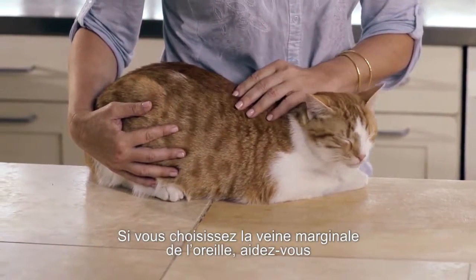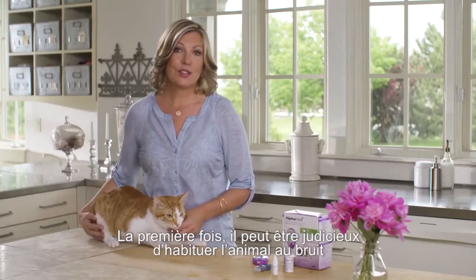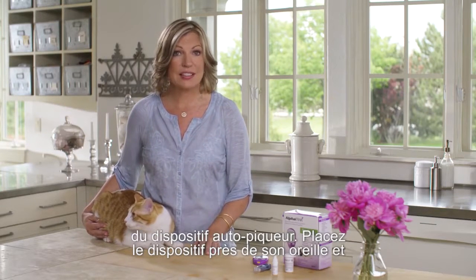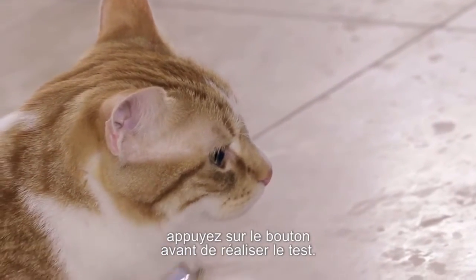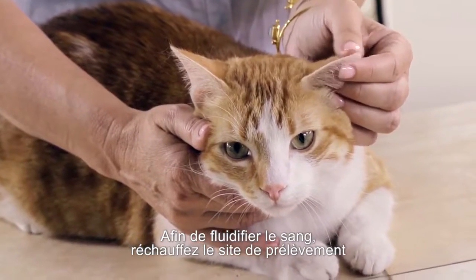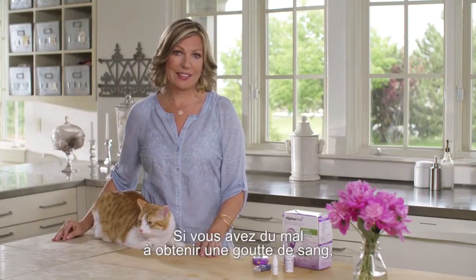If you choose the marginal ear vein and it's hard to see, it may help to use a flashlight to see the vein better. When you first start testing your pet, it may help to get them used to the lancing device sound, so try holding it close to their ear and pressing the button before performing the test. To get the blood flowing, warm the sample site by gently rubbing, applying a warm cloth, or a bag or sock filled with rice that has been warmed in the microwave for 20 seconds.